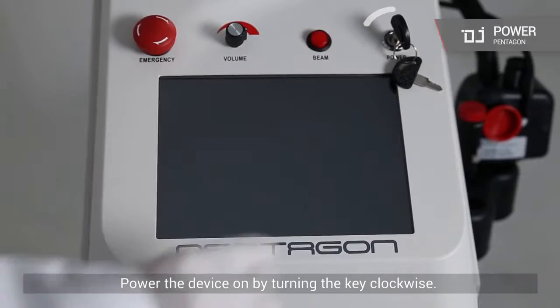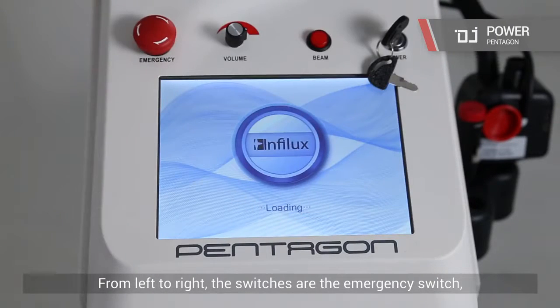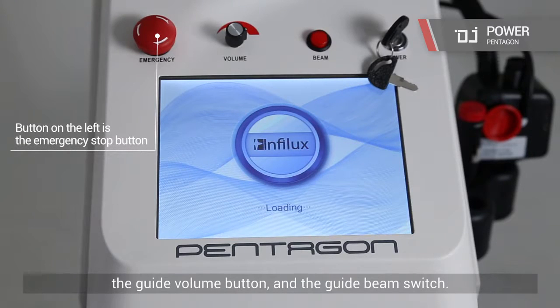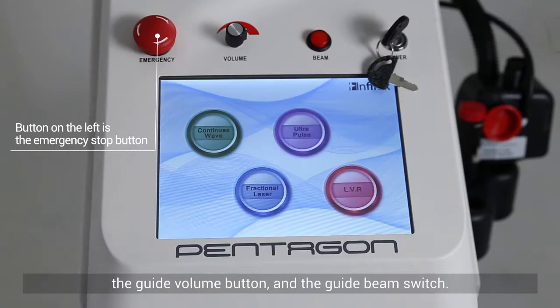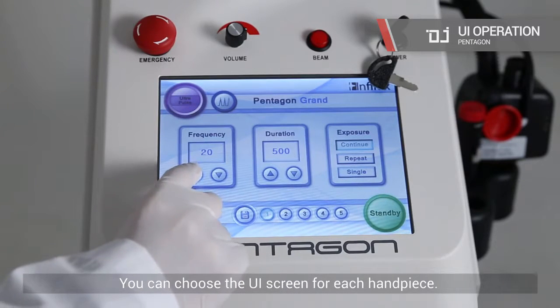Power the device on by turning the key clockwise. From left to right, the switches are the emergency switch, the guide volume button, and the guide beam switch. You can choose the UI screen for each handpiece.